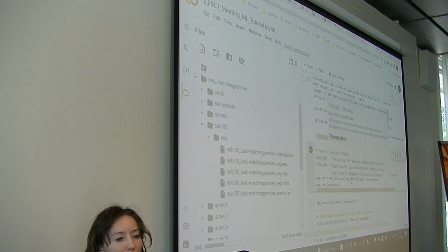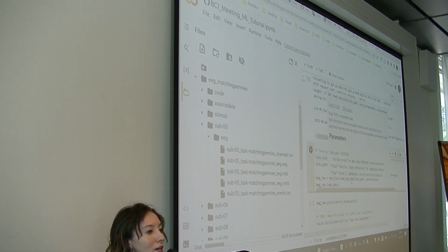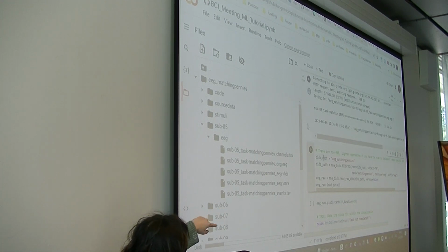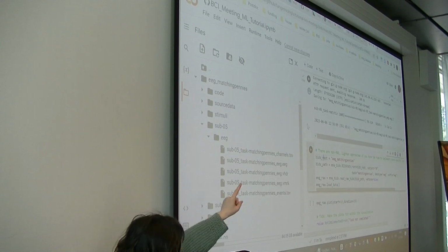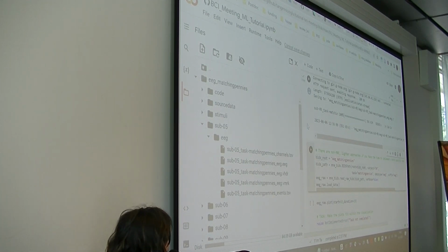But in general, for a lot of time series data, including intracranial EEG, BIDS goes with these EEG, VHDR, VMRK files. So these are the BrainVision format files, and that's again the benefit of using BIDS, because regardless of the brain modality, you're going to end up with the same files that you can process in the exact same way, which is really, really nice.